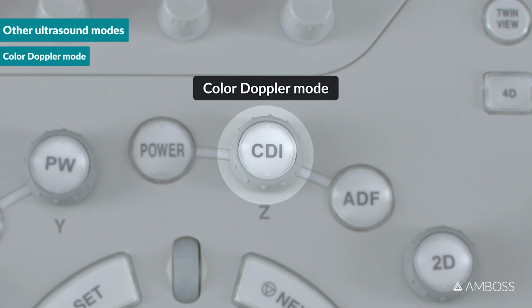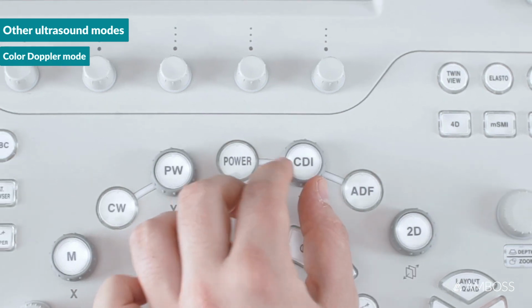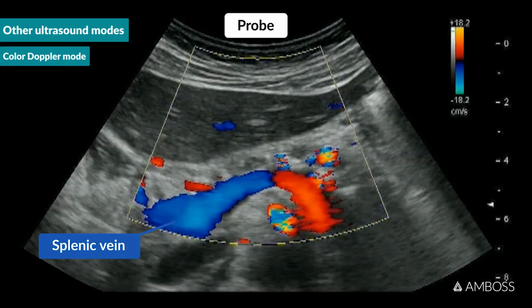Other manufacturers label this differently. For example, C for color or CF for color flow. When Color Doppler mode is activated, a box appears on the screen. Within that box, flow toward the probe will appear red, and flow away from the probe will appear blue.